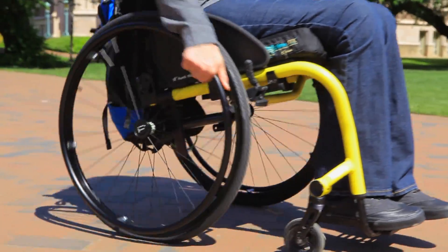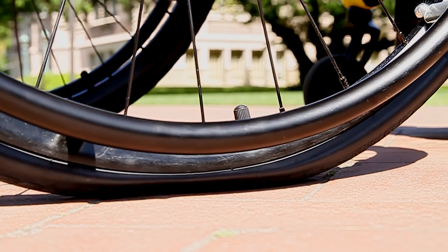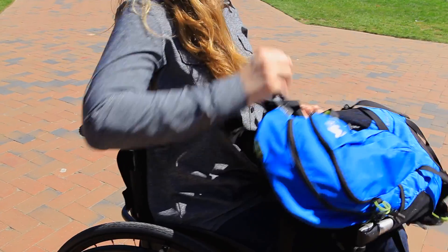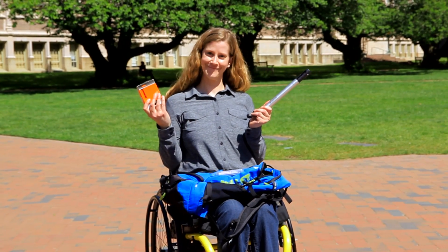Even when you have good posture with well-positioned wheels, you will still have pain and fatigue with pushing if the tires start to go flat. Keep a pump and spare inner tubes with you at all times, and get into the habit of checking the tire air pressure every couple of weeks.